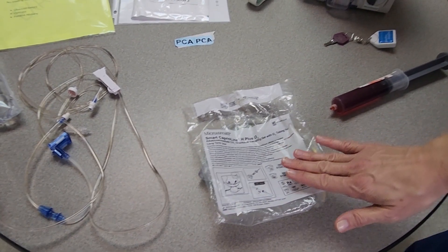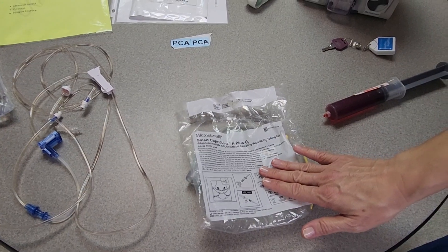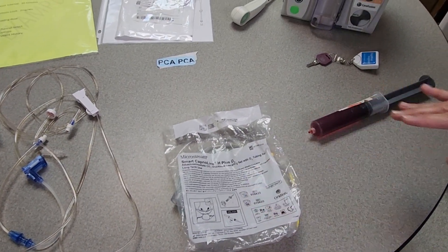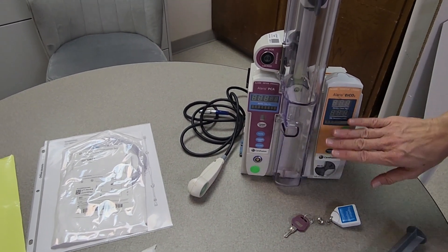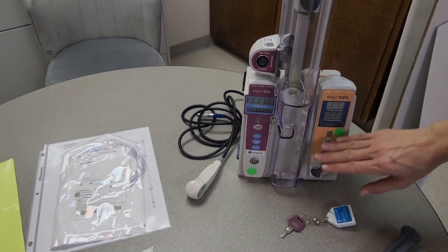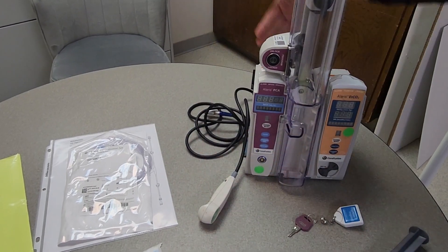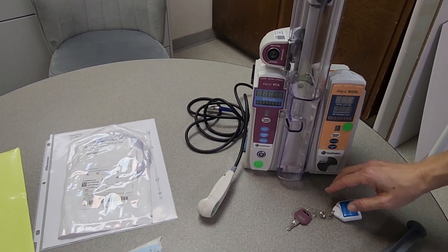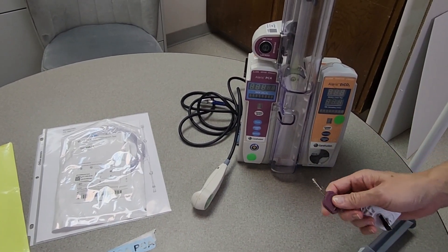You will need your end tidal CO2 oxygen tubing that goes with the PCA, and then you'll have your PCA channel as well as the end tidal channel. The patient-controlled button should be attached to the back of the channel and you will need to get that plugged in when it's ready to use.